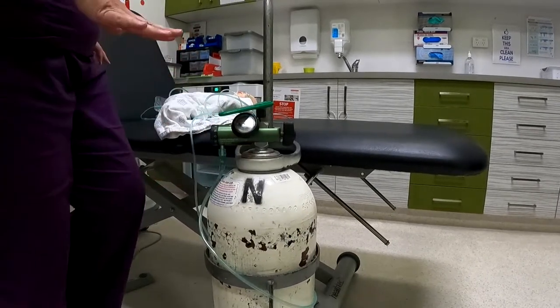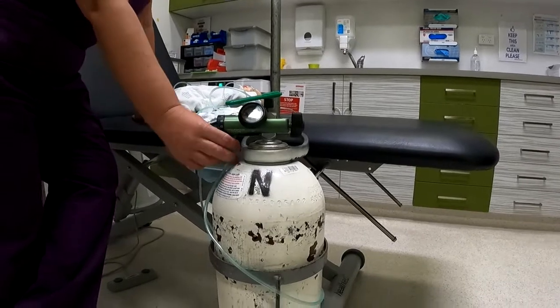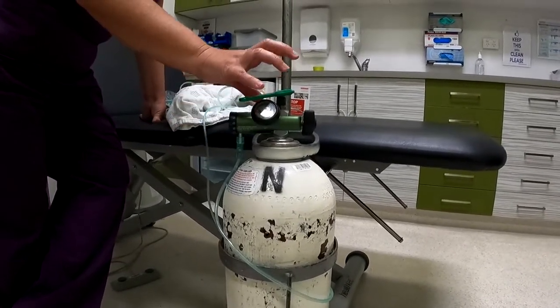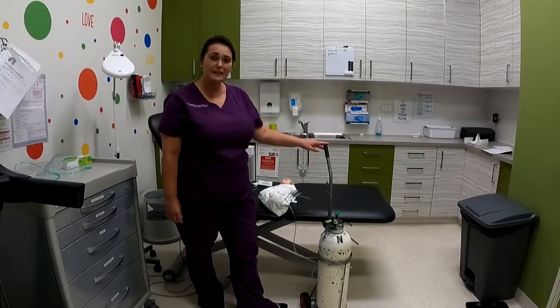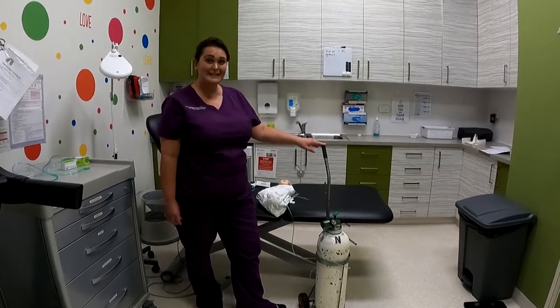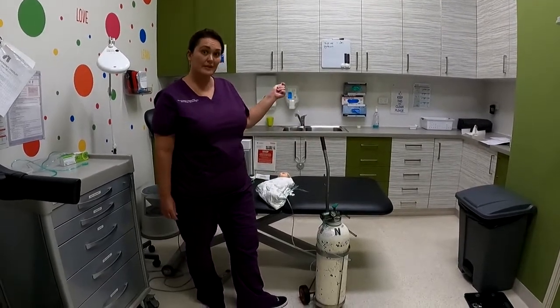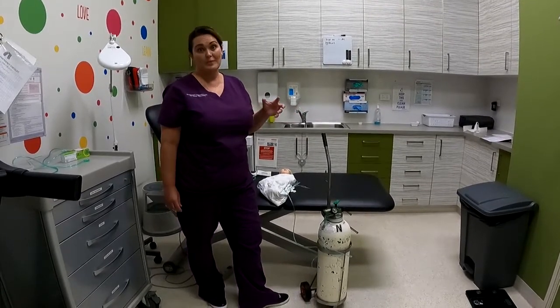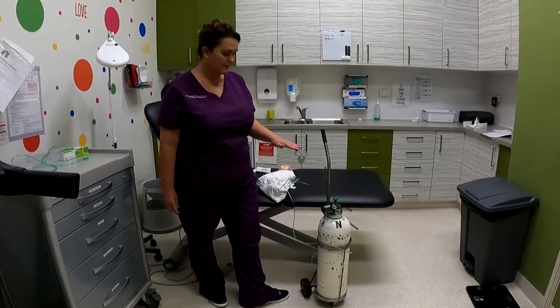This needs to be done, like I said, very regularly, but also check your regulator is working okay by checking for oxygen when you change your regulator over or you're going from tank to tank. If you can't hear or feel any oxygen, it may indicate a problem with your regulator. So quickly change them onto another tank and regulator and ring your oxygen company or MAS and let them know that this has happened and you need a new regulator.